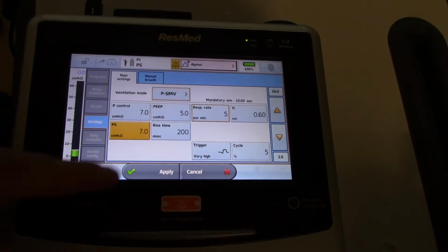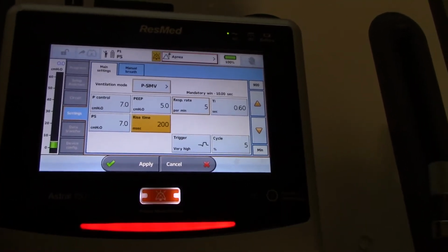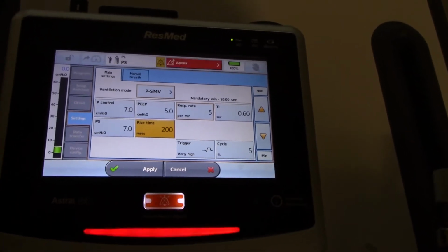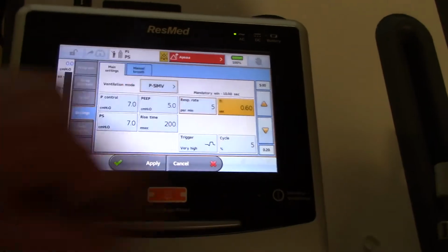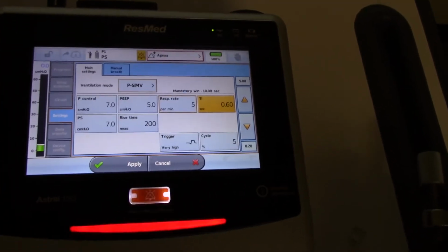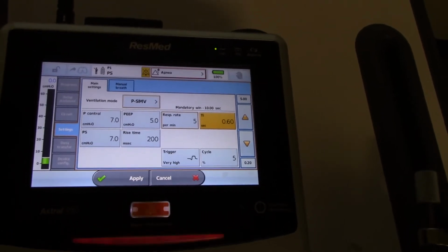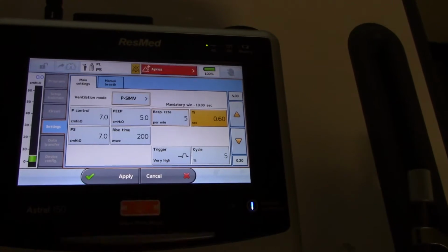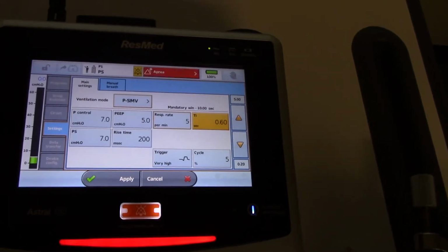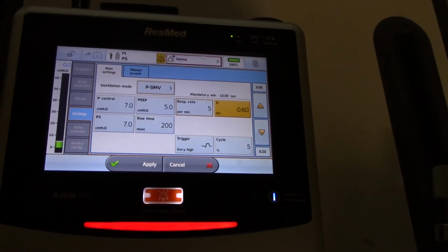Pressure support ordered. Your rise time is again usually not ordered, and we're going to set that to attempt to get a decelerating waveform, which we're going to do on this vent as well. You have your I time. If it's not ordered, we're going to set that just like we do on the servo to get at least a zero flow waveform within the patient's age group on our waveform on this vent as well. And if you can't get to zero flow, you're going to need an order for that, or if the physician chooses to order it, you'll have an order for that.